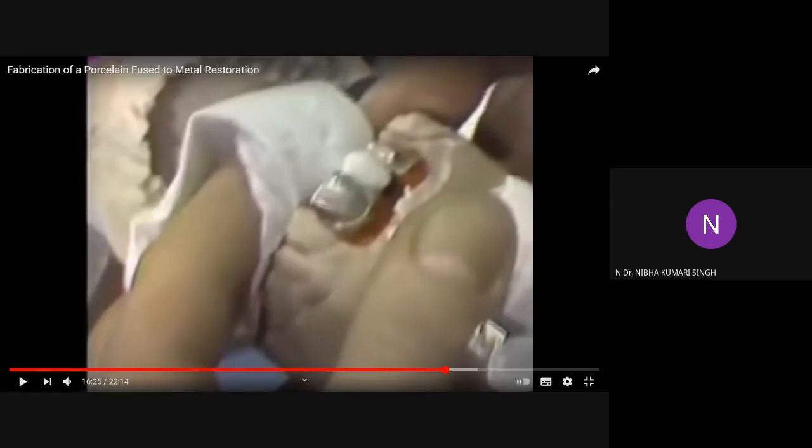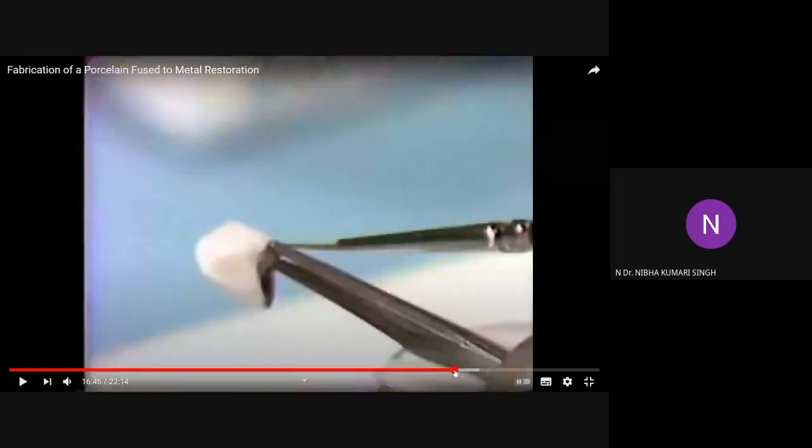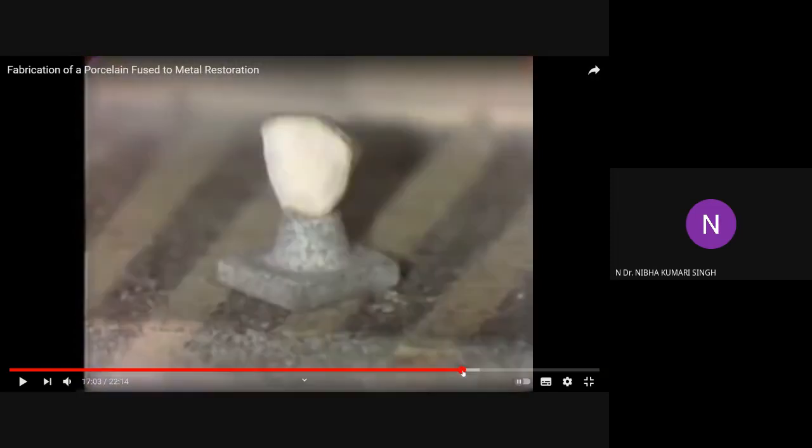What is self glaze? You have to reheat the crown after you check the high points and everything in the patient's mouth. You reheat the crown surface, so the outer layer on the surface, which has a chalky texture, will melt and flow into the pores. It seals the porosities and gives a natural, reflecting surface.